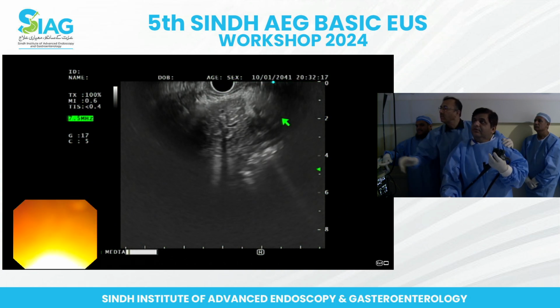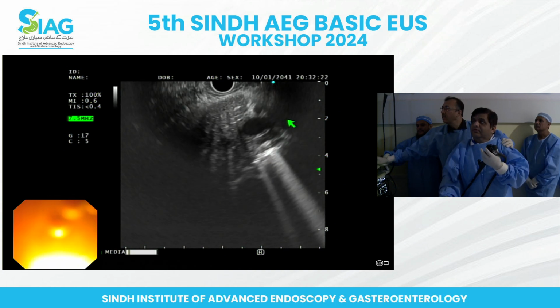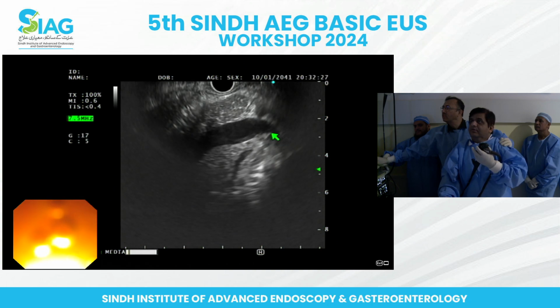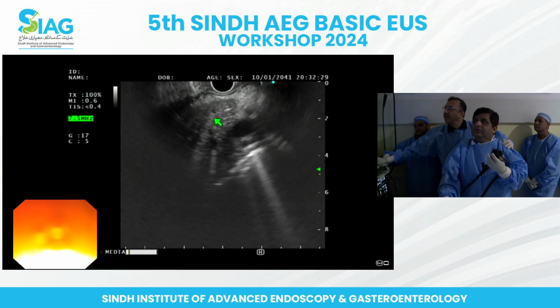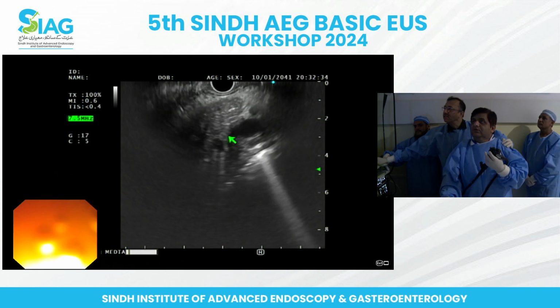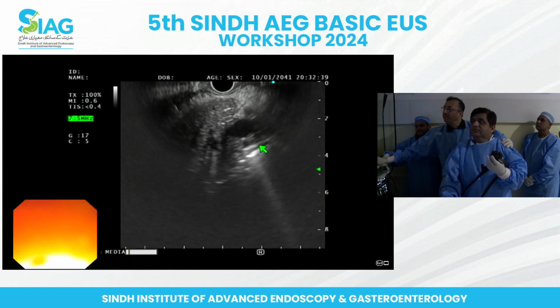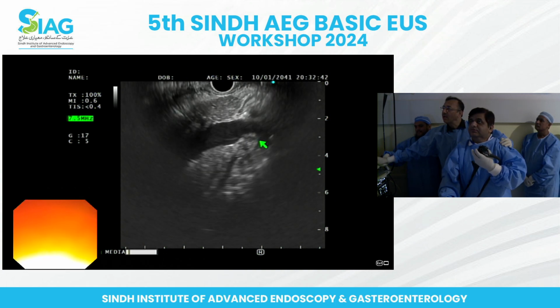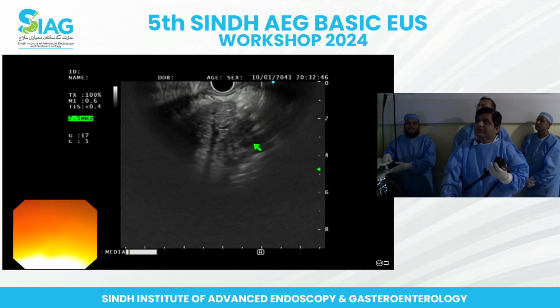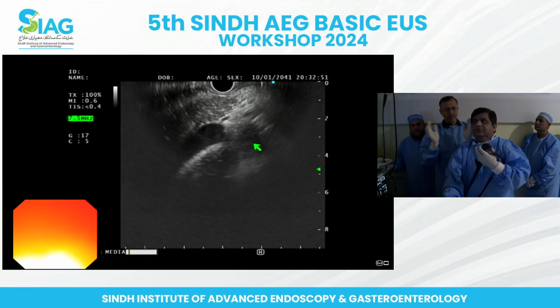This is the splenic vein on this side. This is the splenic vein right here. This is the portal vein becoming confluent, the splenic vein directly joining it. And this is the pancreas, going down in parallel to the portal vein. And we are heading there. And over here, beyond the portal vein, you are going to have a slight glimpse of the CBD. Just think that you're going around like this. Stomach is a very compact area.